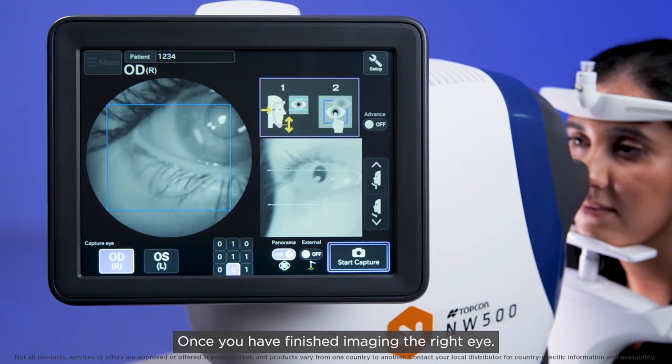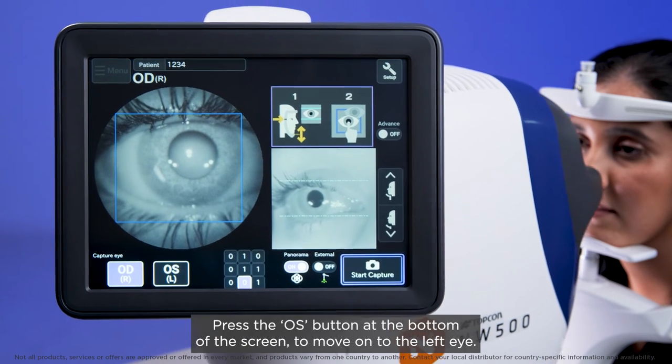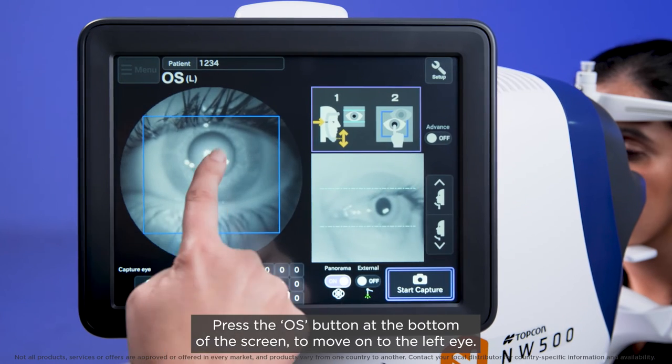Once you have finished imaging the right eye, press the OS button at the bottom of the screen to move on to the left eye.